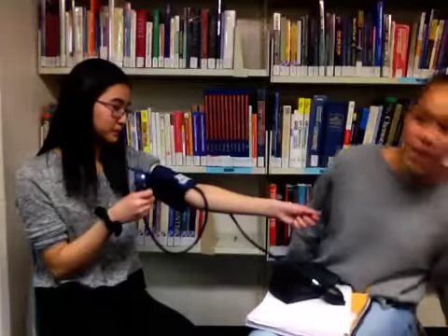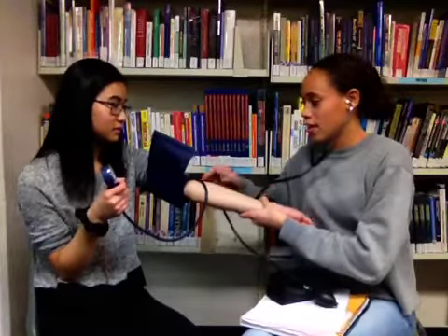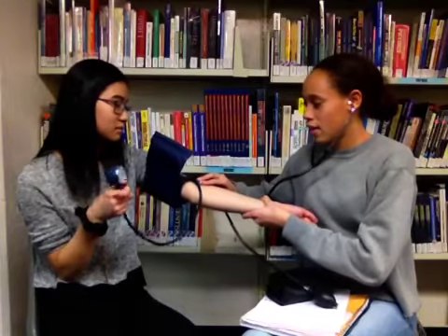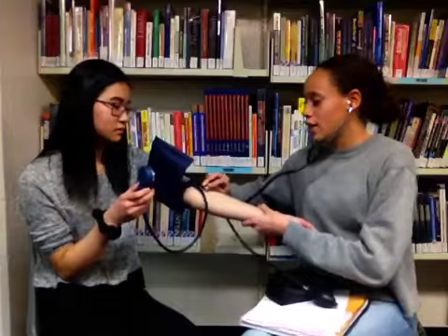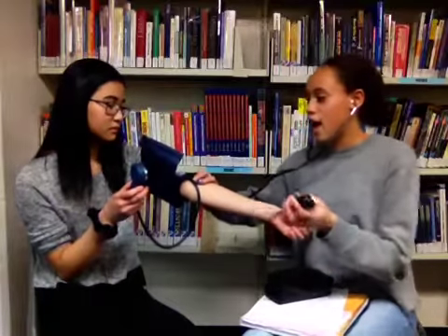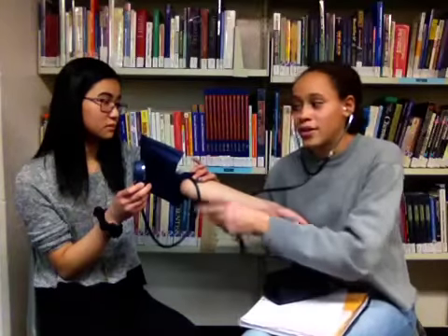After you place your cuff on, you want to put the stethoscope on and place it on the pulse. Once you've found the pulse, you're going to inflate the cuff to approximately 200.